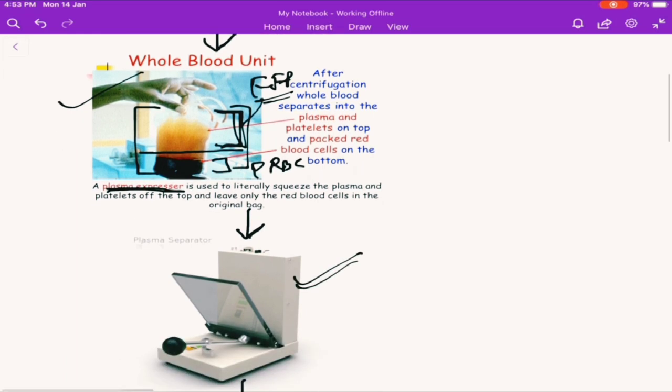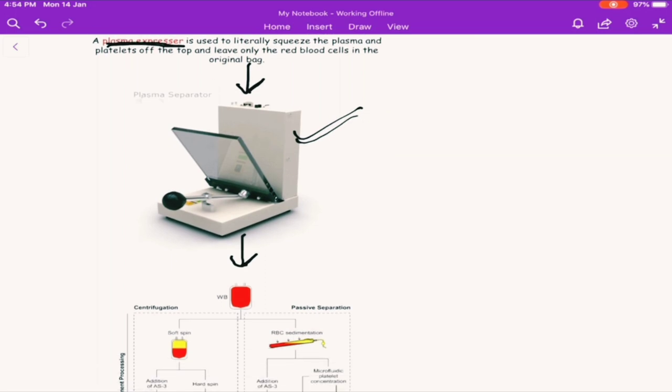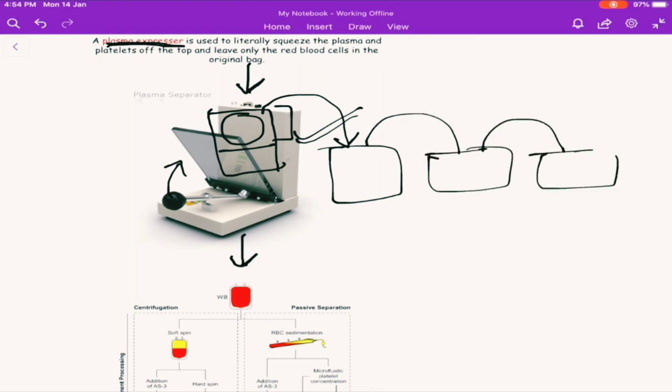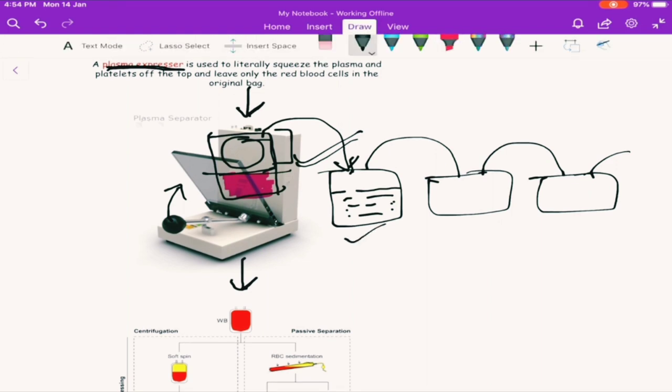This is the expressor machine. What it does is: we place the blood bag right here, and from the blood bag we manually compress it, so it separates out the plasma component into another bag which is already connected. It separates out this component into the new bag. So the plasma component separates into the new bag, and the RBC component remains in the original bag. This is the RBC component — it remains here. The whole plasma component has now shifted towards the other bag.